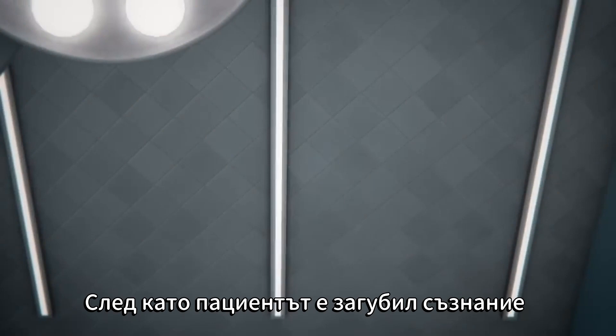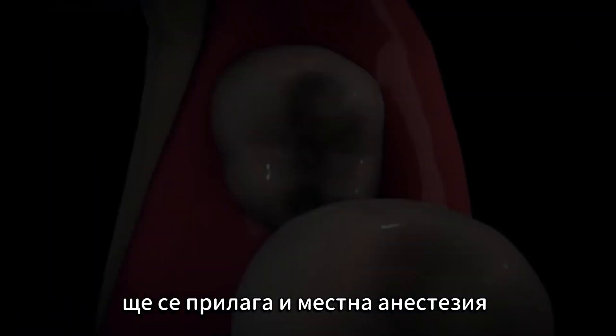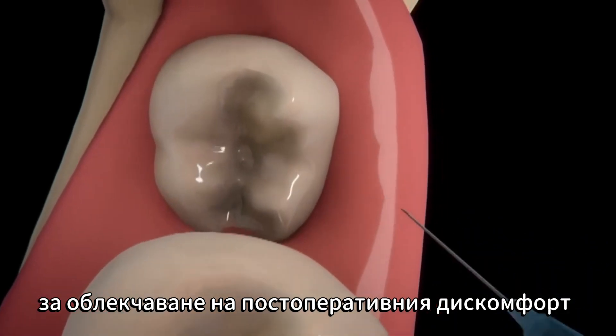Once the patient has lost consciousness, a local anesthetic will also be administered to alleviate post-operative discomfort.